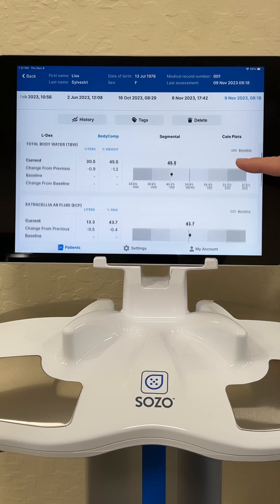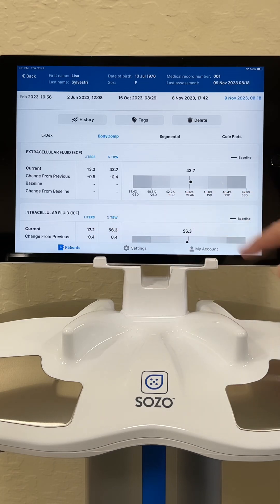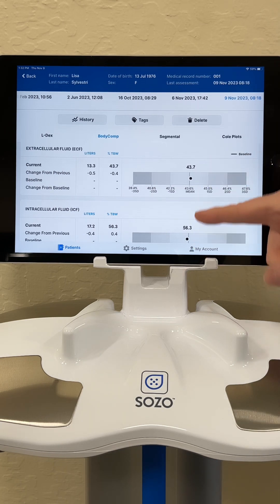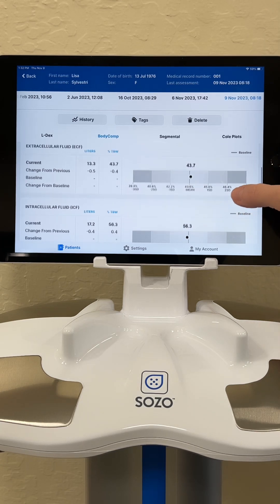As we scroll down, we can see the measures of my extracellular fluid and intracellular fluid — what's inside the cells. If we have high extracellular fluid, this is going to be the measure of lymphedema in our extremities. We like to see a nice, balanced, even extracellular and intracellular fluid. So there I'm doing well — no swelling, no lymphedema.